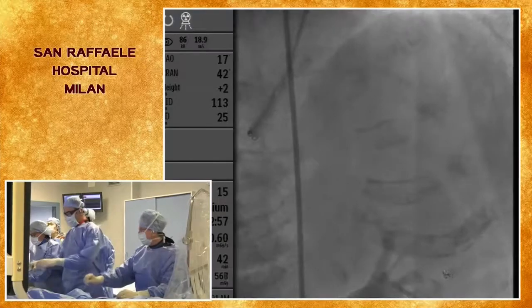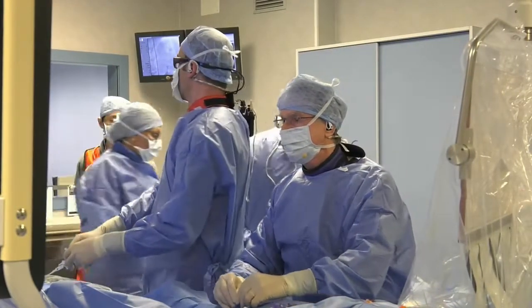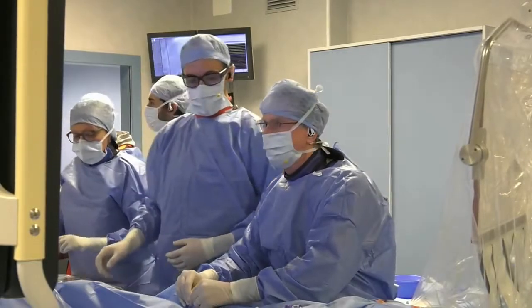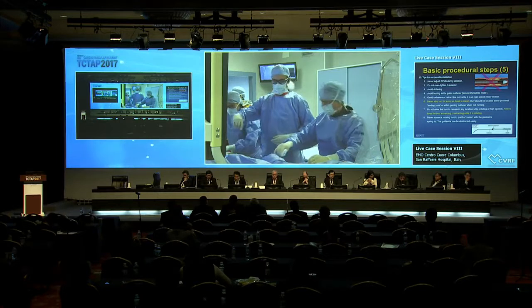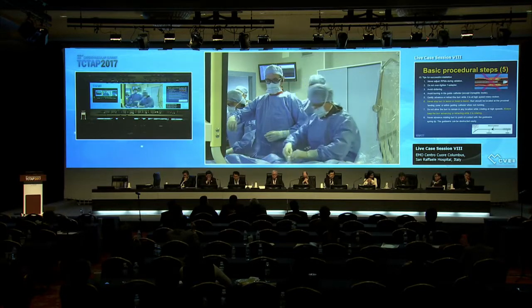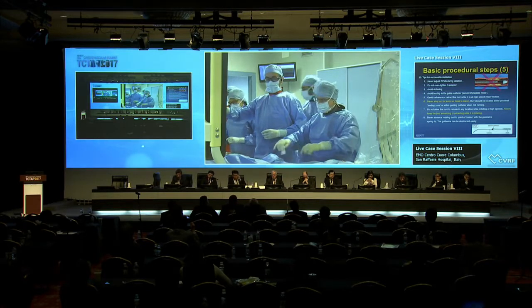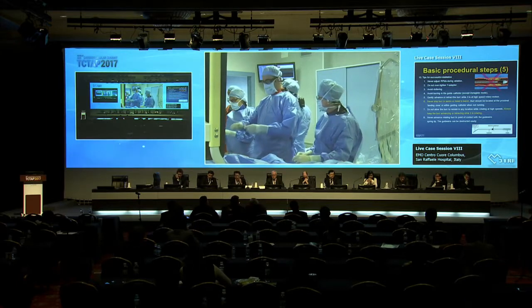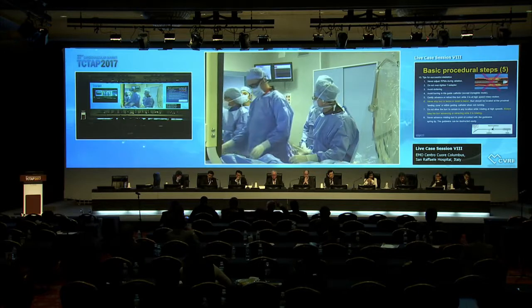Let's open a new one, the new over the wire. Over the wire, 1.25. Michele. Just to do a wire exchange. You know, we could have tried with the wire, but I think it's just more cheaper. Safer to do like this.